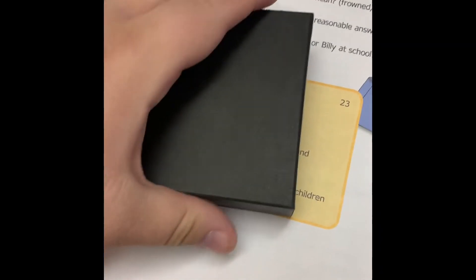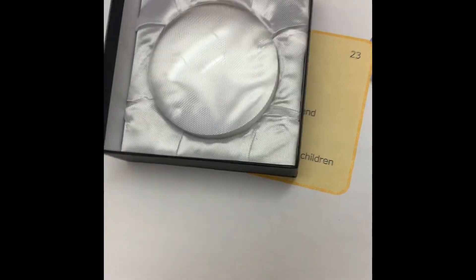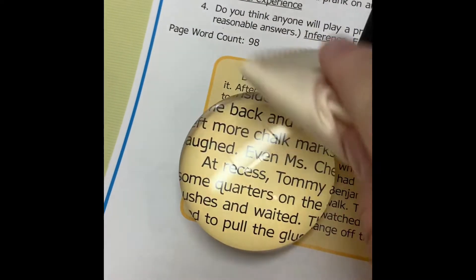This beauty right here is your dome magnifier. Take good care of your dome — sometimes it gets fingerprints all over it. Clean off the top, the sides, and the bottom regularly so that the fingerprints don't keep you from being able to see.